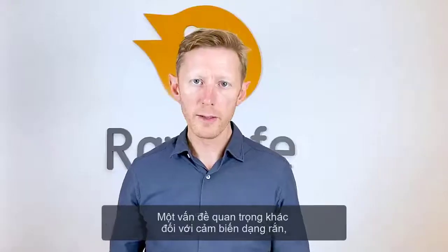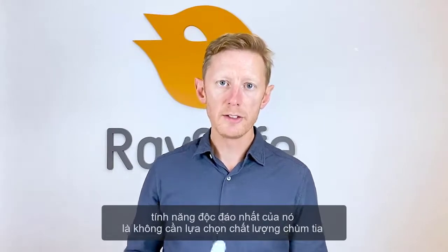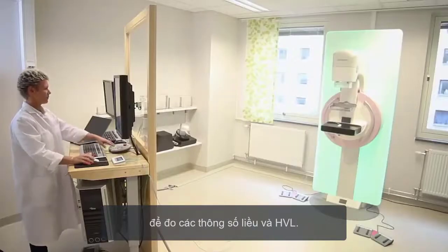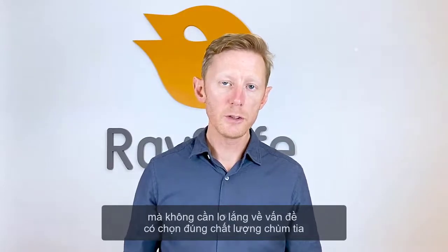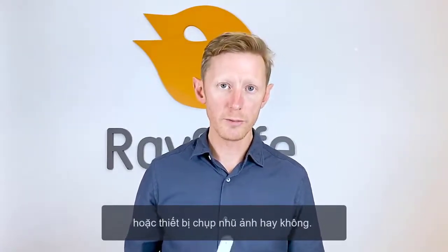Another important and for solid state sensors truly unique feature is that no beam quality needs to be selected to measure both dose and HVL. This means that you can trust your data and don't need to worry whether you selected the right beam quality or right mammography machine.